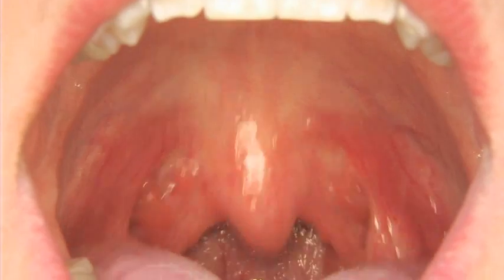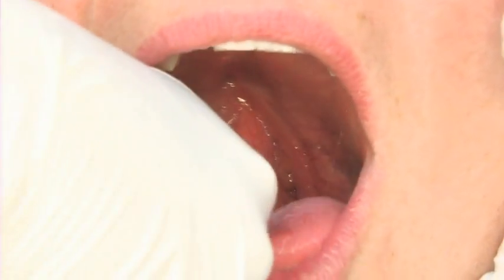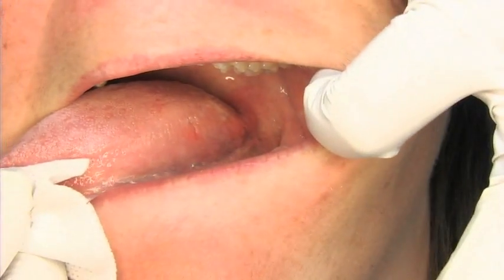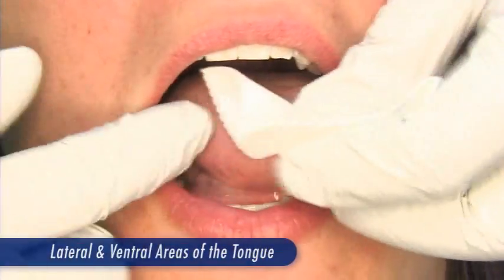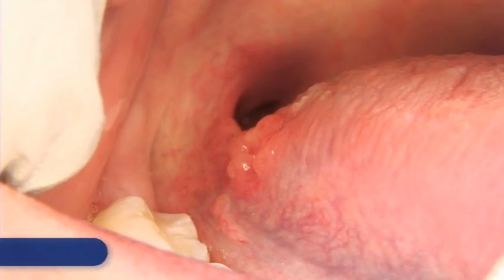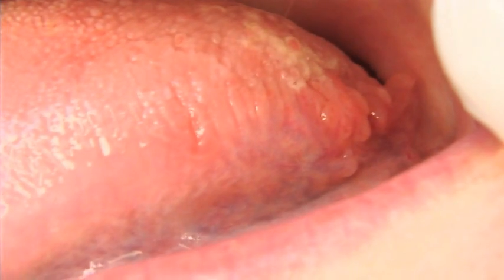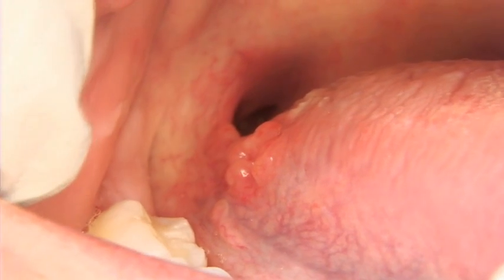Unexplained earache can be associated with pharyngeal cancers. Palpate the base of the tongue behind the circumvallate papilla using a sweep of the finger — this area is hard to see without special equipment. Pull the tongue forward gently, getting a firm grip with gauze, in order to view the entire dorsal tongue. Wipe away any debris. Closely inspect the lateral and ventral tongue along its entire length. This is where half of all oral cancers arise. The red nodules bilaterally on the posterior lateral tongue are foliate papilla, corresponding with the nodules seen in the pharynx.